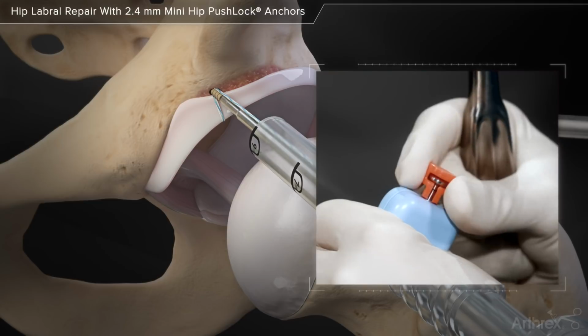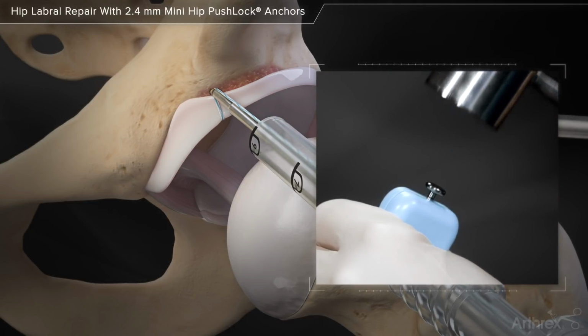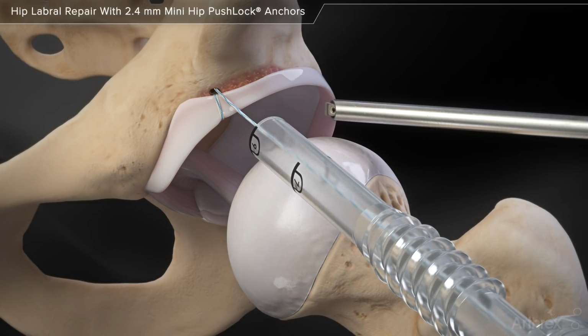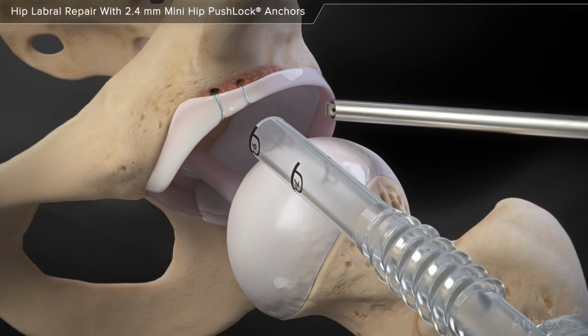The orange cap is removed once the barbed portion of the implant is flush with the bone and the barbed anchor is impacted until the laser line is buried in the bone socket. The inserter handle is removed and an open-ended suture cutter is used to cut the sutures flush with the bone socket, and additional implants are inserted as needed.